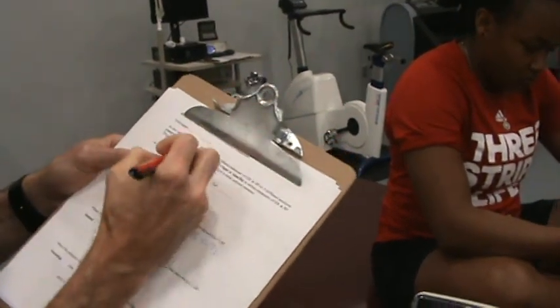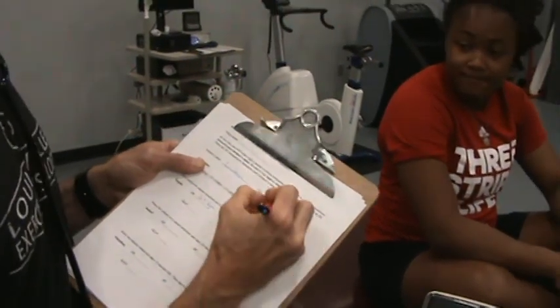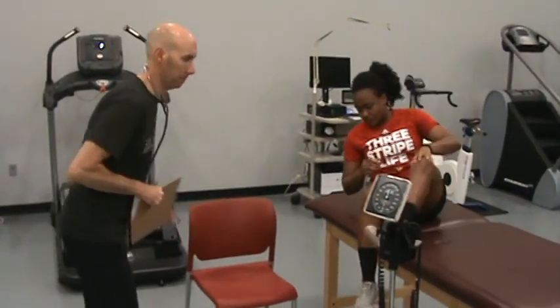I did forget to ask Lindsay her age. What's your age, Lindsay? 25. All right, so we have her supine numbers. Now we're gonna do a seated cardiovascular assessment on her. So what I'll have her do actually is move to the chair.